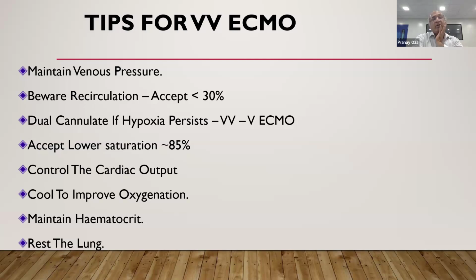Control the cardiac output, cool the patient. If oxygenation is not improving, you can cool the patient also. Maintain good hematocrit. Most important is to give rest to the lungs.